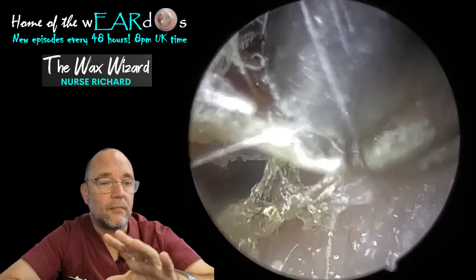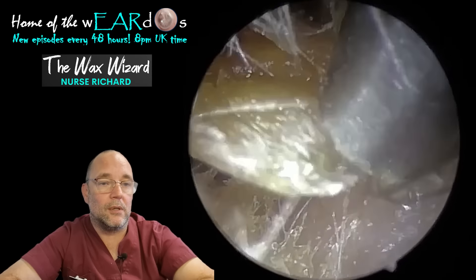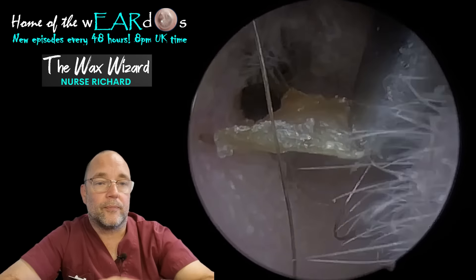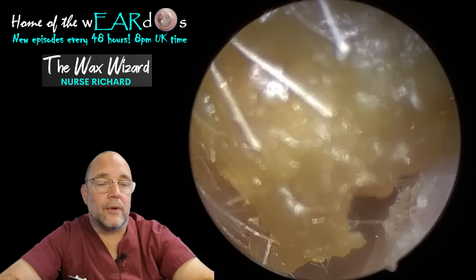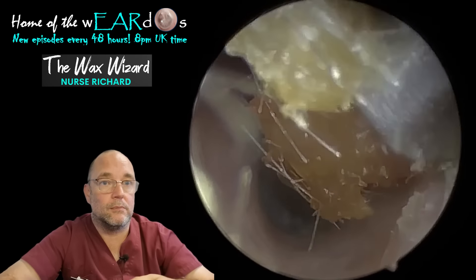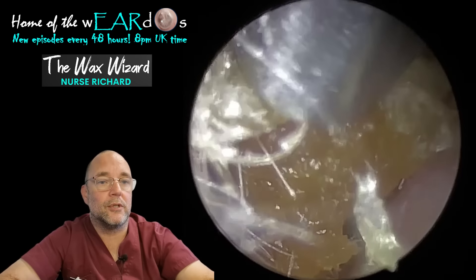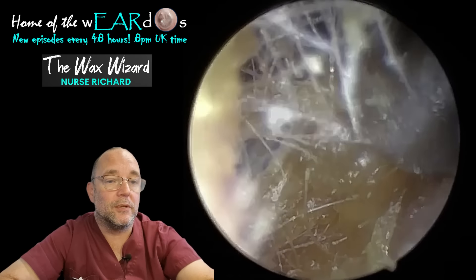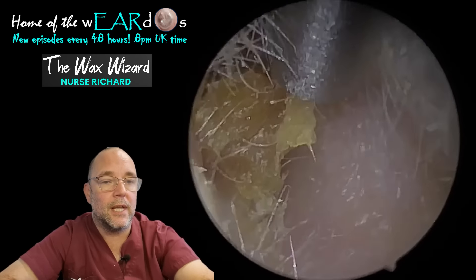Which is great. And I will keep you posted on this one - whenever I hear something from the lady, I have asked her to keep me updated. This was the other ear, which wasn't much of a problem at all. You'll see it's nice and clean afterwards, but there obviously was still a little bit that needed to go. And I used this ear, actually, to show her the difference between what a normal ear should look like. And obviously she'd already seen an abnormal ear, so she was really shocked when I explained what might happen.